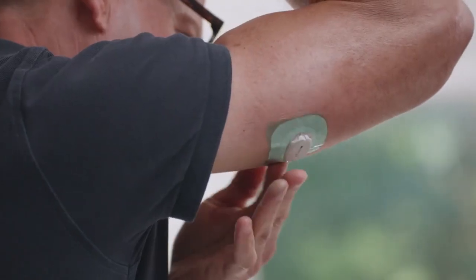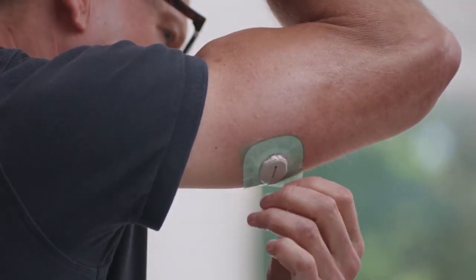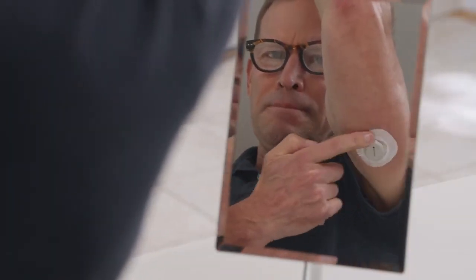Use the colored tab to place the overpatch around the sensor. You may need to look in a mirror for this part. Rub around the overpatch. Use the tab to peel off the colored liner. Lastly, rub around the overpatch.